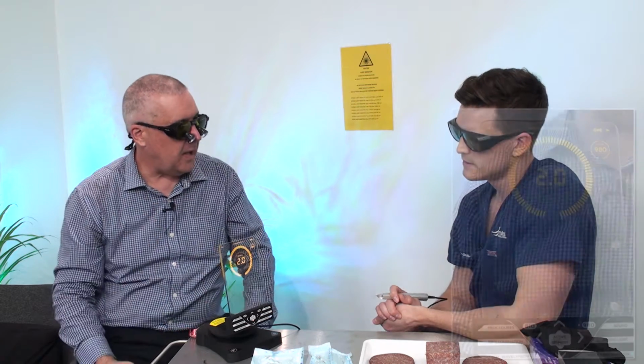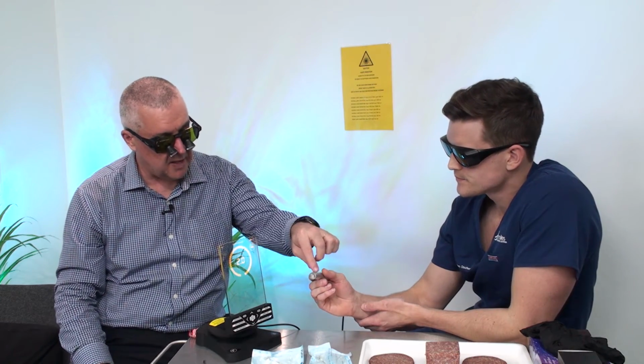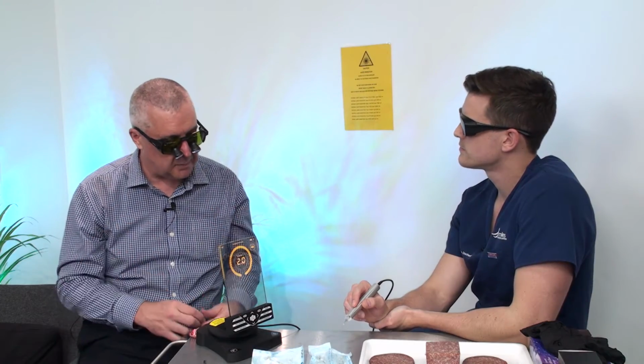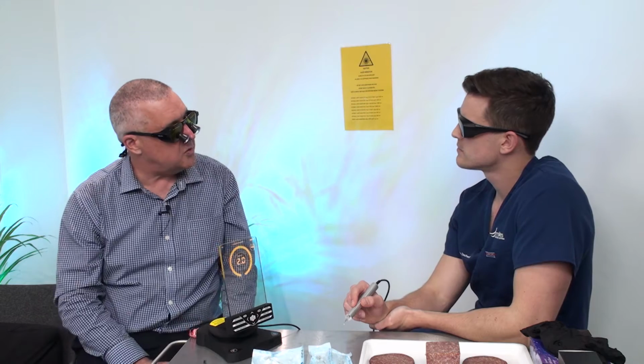Turn the little aiming beam, the little torch, on in the tip. Low. Yeah. So we have basically a little torch built into the end over here with a couple of little white LEDs. I found that really useful for doing tuberosity reductions and operculectomies, where you're tucked around down the back and things can get a little bit dark, or you're working around a corner. Having a built-in torch, I've often found really useful when I'm working down the back. Have you ever used it very much?